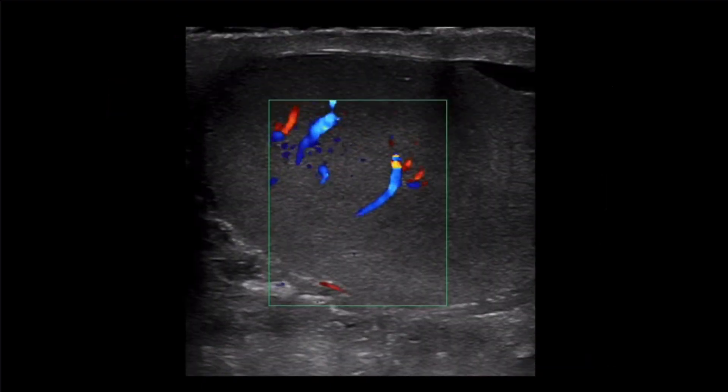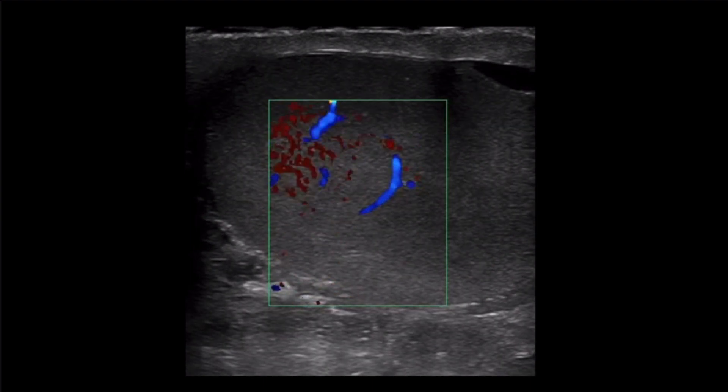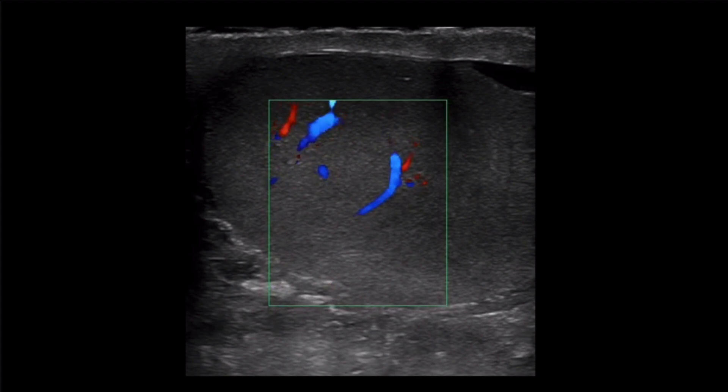The human body often provides us a comparison structure when we are evaluating for pathology. With that in mind, the treatment team visualized the right unaffected testicle. Color Doppler was utilized showing flow.